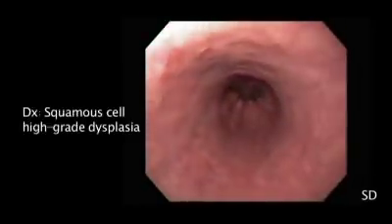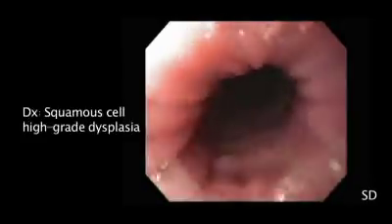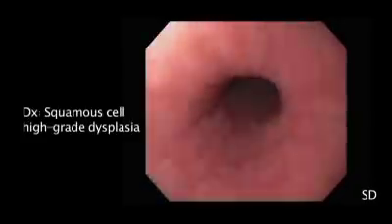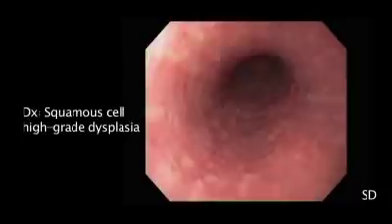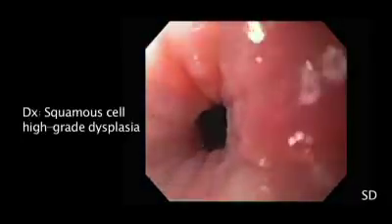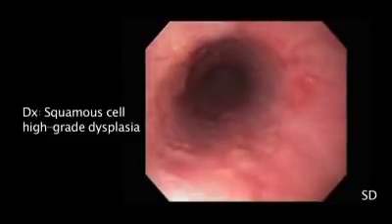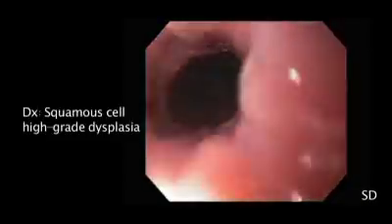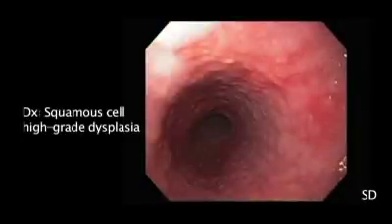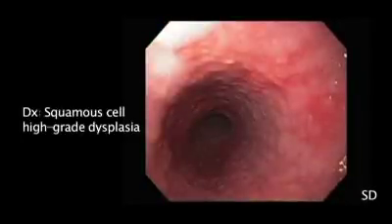Squamous cell high-grade dysplasia and early carcinoma can be non-polypoid, being slightly elevated, flat, or depressed, and only recognized by its slight erythema. Careful inspection of the esophageal mucosa was performed in this high-risk patient with a history of heavy tobacco and alcohol use. There was an area of subtle erythema raising suspicion for a malignant lesion.